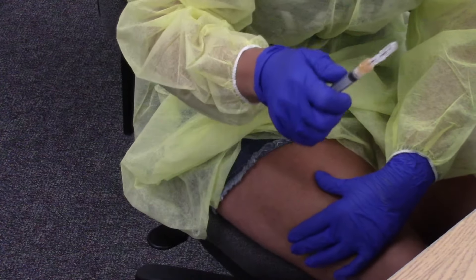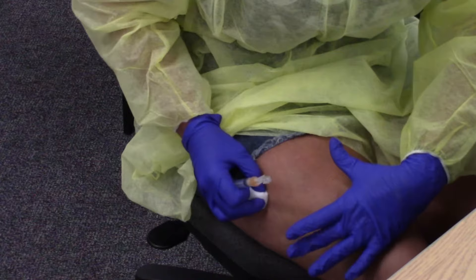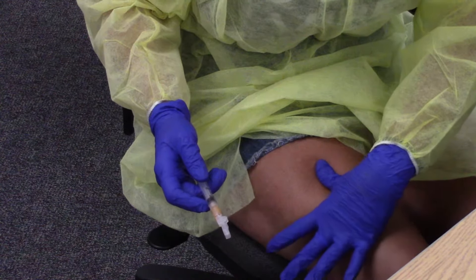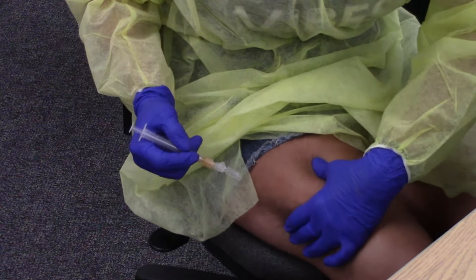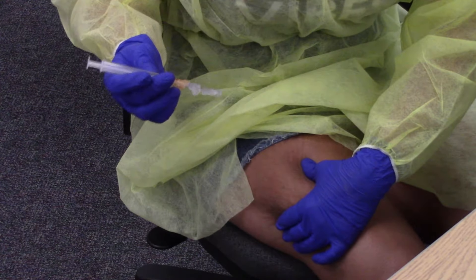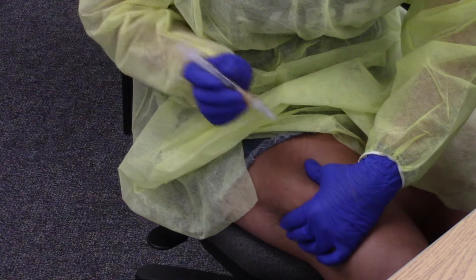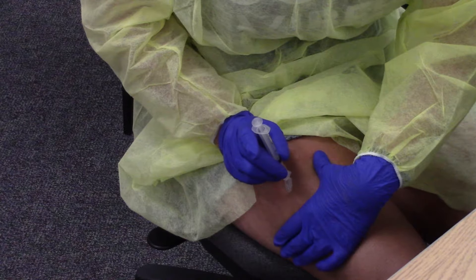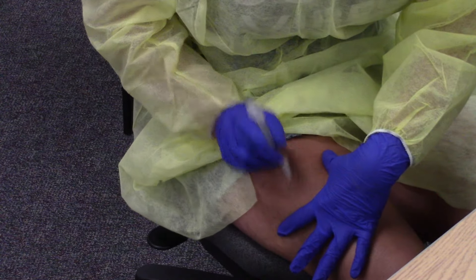For the intramuscular, clean about one to two inches away from the same site. Locate your femur and grab more of that muscle mass — you want to feel the muscle in your hand. This will be a one to one-and-a-half inch needle. You've got muscle mass, so go straight down, aspirate, then inject, and straight up.